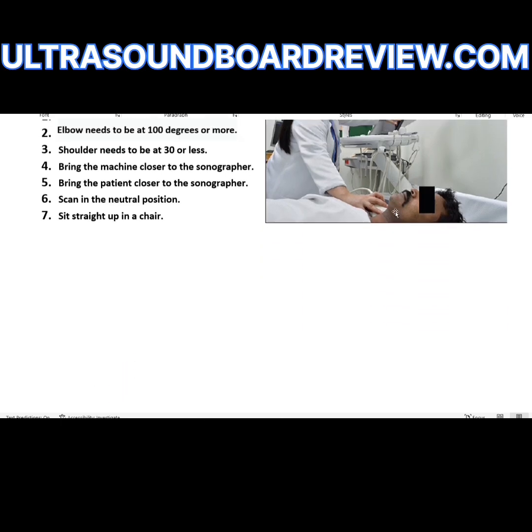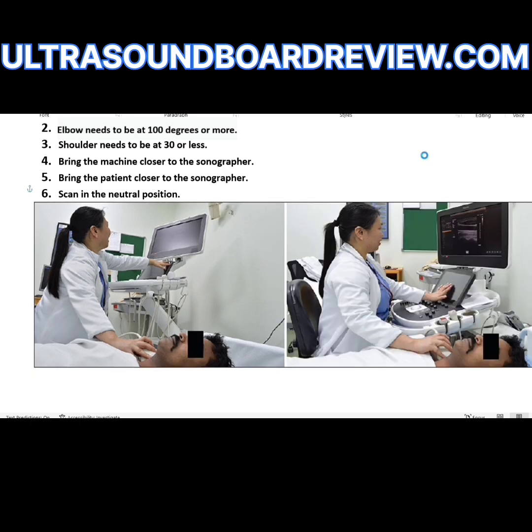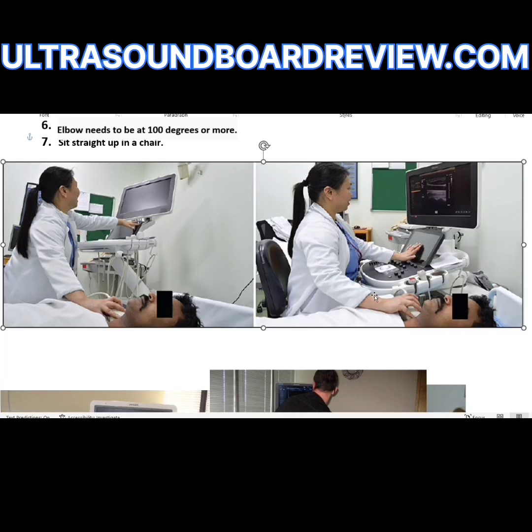You'll see what it should look like here — that's a lot better. She's sitting straight up and she doesn't have to reach across the room to touch one of the knobs. She's got the monitor at eye level, she's not leaning over the patient, the shoulder's at 30 or less, the elbow looks a lot better, and she looks like she's scanning in the neutral position.